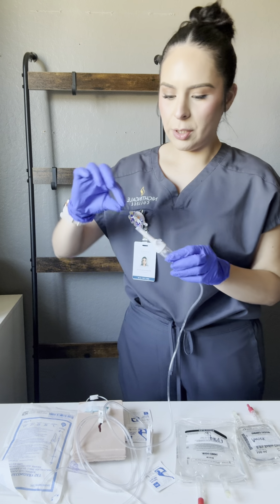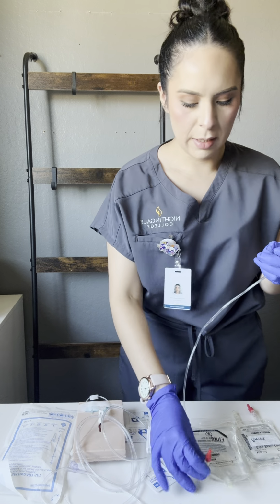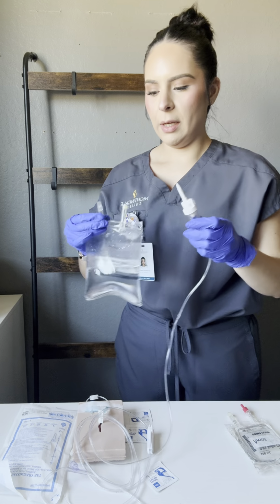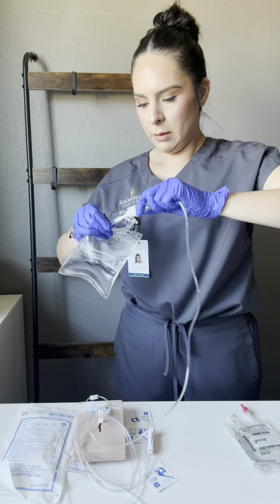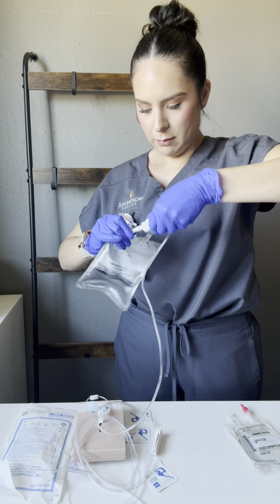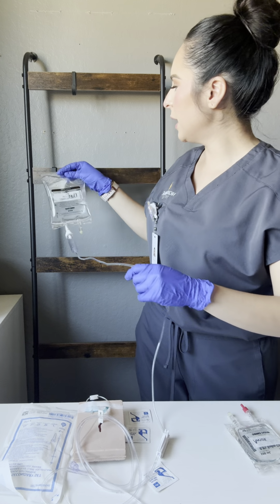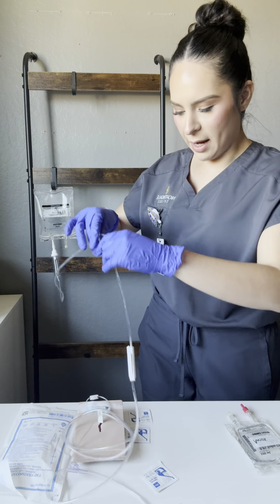So I am going to remove the end cap from my spike, and then remove the end cap for my fluid. And then I'm going to spike the bag. I'm going to want to make sure that I'm hanging my fluid at least 30 inches above my patient's IV site.